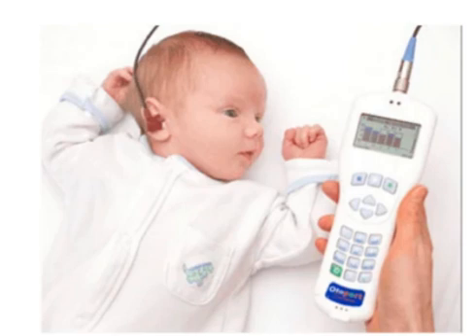Following Kemp's discovery of the cochlear amplifier and OAE, he discovered that OAE could be measured from patients with a normally functioning cochlea but not from those with hearing impairments with thresholds over 30 decibels HL, illustrating the potential of using OAE as a hearing test. Thus, the presence of OAE is indicative of a functional cochlear amplifier, healthy OHCs, and normal hearing.